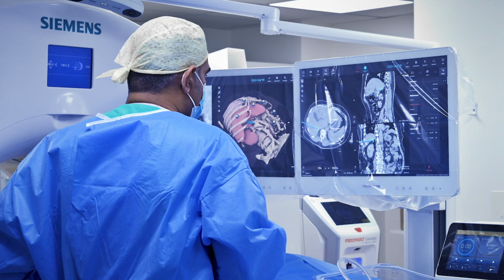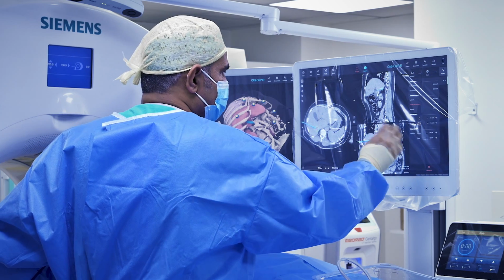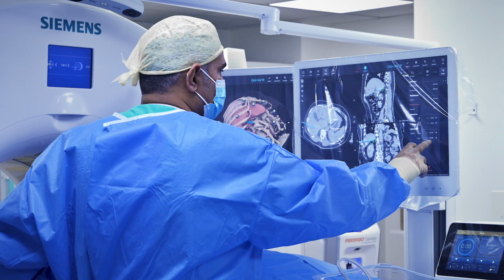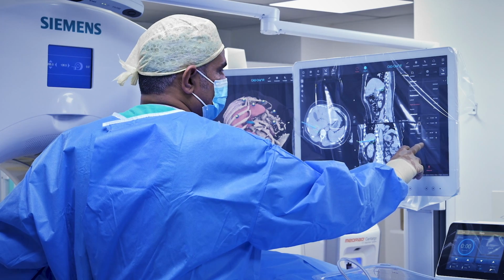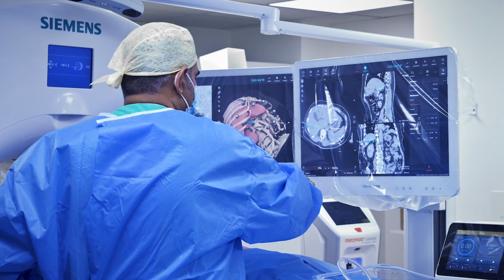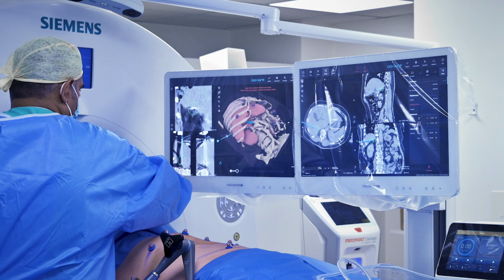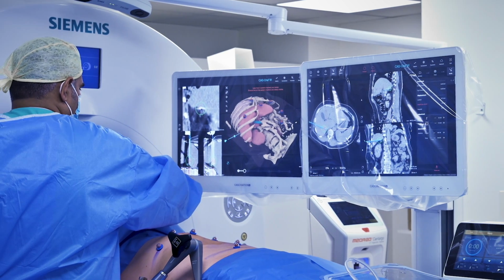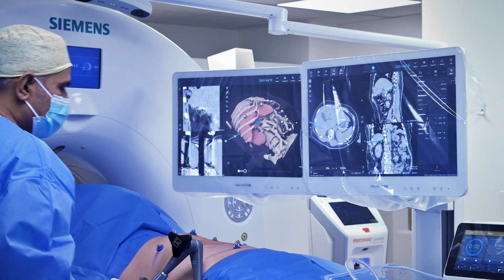The good thing about microwave is that you can always, if you're worried a bit about the lateral margin, just change the size of your ablation zone to make sure that you get it all, which I think we will here. Over on this screen we have the down the needle view. I think it's pretty close, and I'm reasonably happy with that.